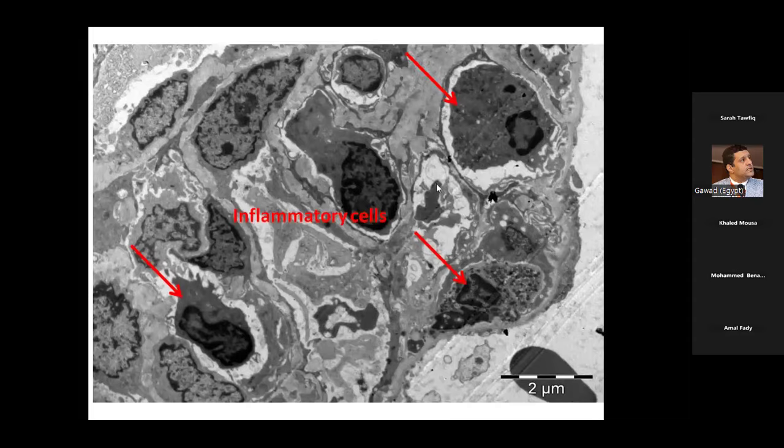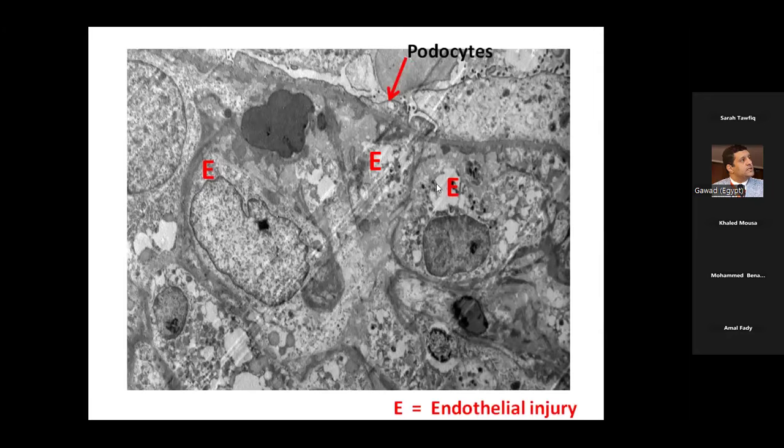What is this? Is it an inflammatory cell or is it something else? No, these are not the most clear pictures I have. But I just want to say that because if we have colleagues of nephropathology, sometimes we get lost. Okay, let's continue.